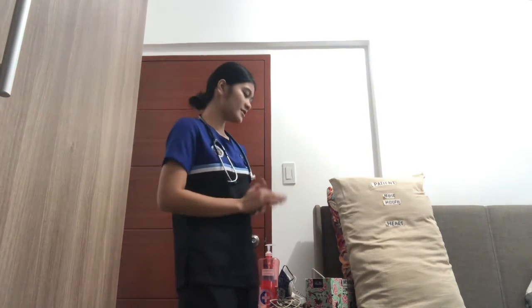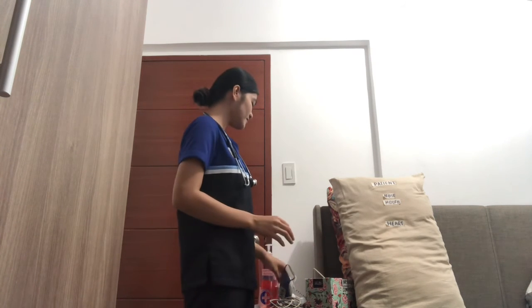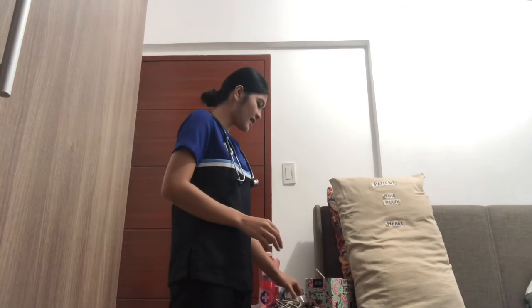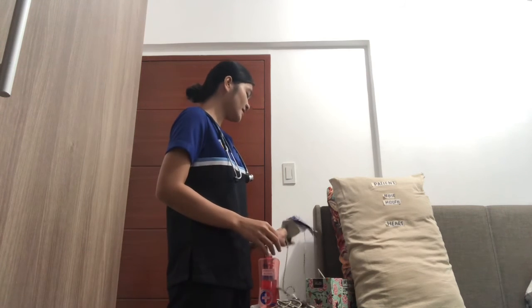So, after that, we will now do aftercare of the equipment. In doing aftercare of the equipment, we should clean all the equipment. We should wash the connecting tubing with water as well as the baffle, and also disinfect the face mask for later use.